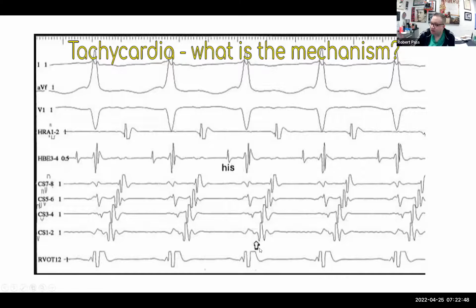And we see here that there's a little arrow somebody drew to point out the presence of the retrograde P wave in the distal coronary sinus as the earliest. So this is correct. This is a so-called eccentric pattern, suggesting that it's coming far from the AV node, left-sided. So we would have to do transeptal, or alternatively go retrograde, cross the aortic valve, and retroflex the catheter back over to the left lateral position.